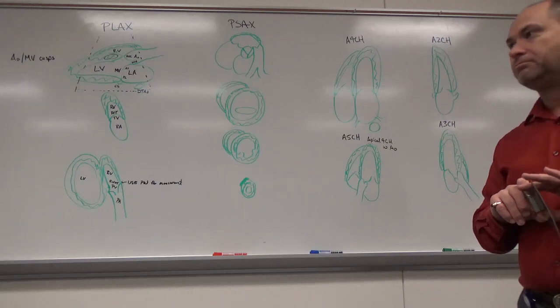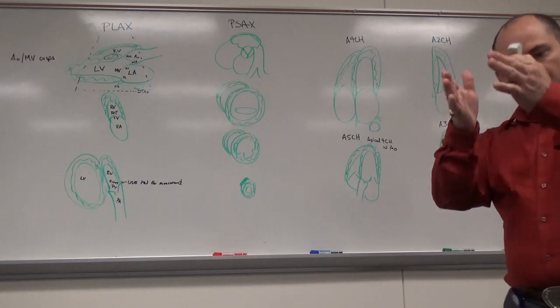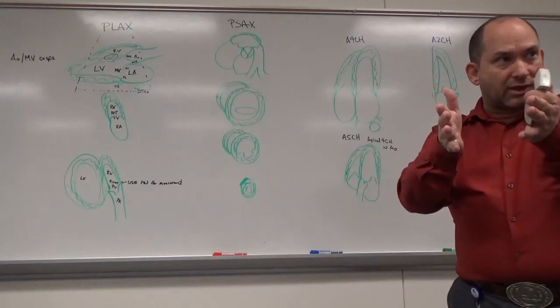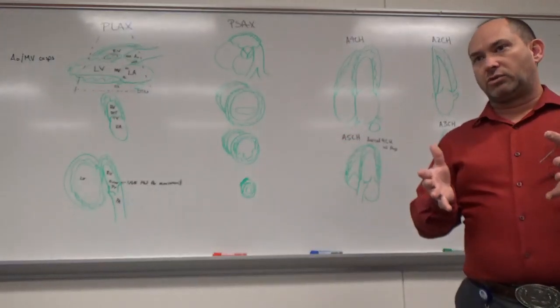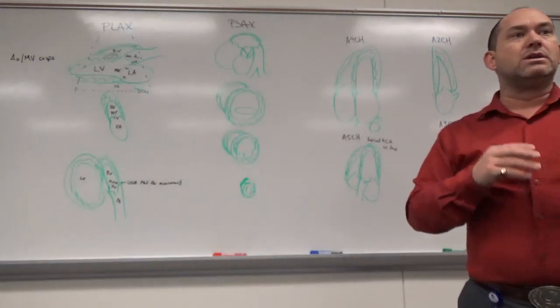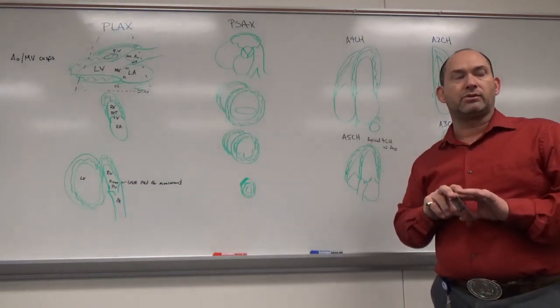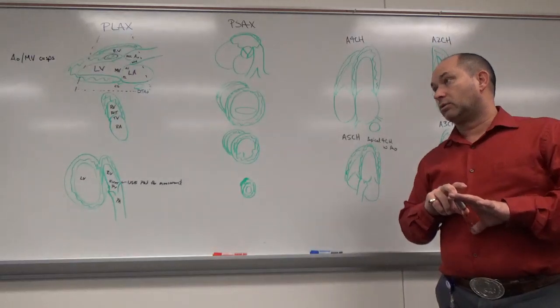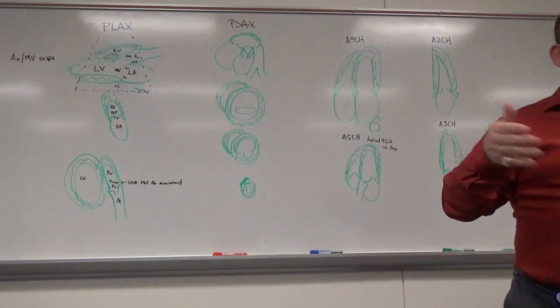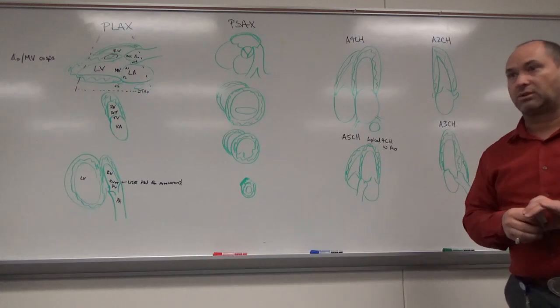We decrease the area. Yeah, so we've got this tubular shape. It's kind of conforming like this, and then it comes in a tubular shape. That's going to have typically fairly laminar flow, but if I've got a valve inside there, in a normal valve it doesn't restrict it much, but it still is more restrictive than the open chamber is. So inherently a valve should be more stenotic, so to speak, or a higher flow velocity through the valve tips than through the rest of the chambers. Okay, so CW goes through there because theoretically, if there's nothing else going on, the highest velocity should be there, and we want to catch that with continuous wave Doppler.